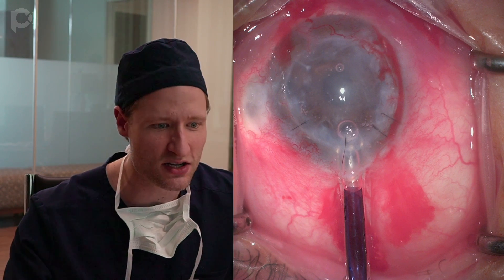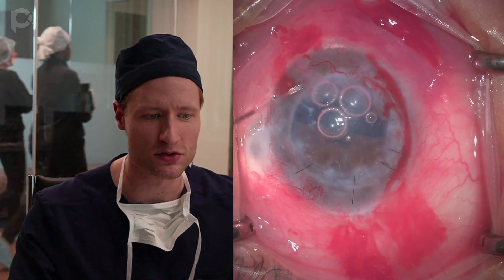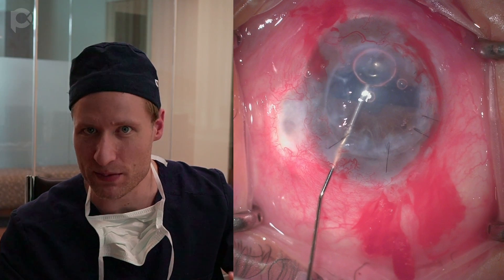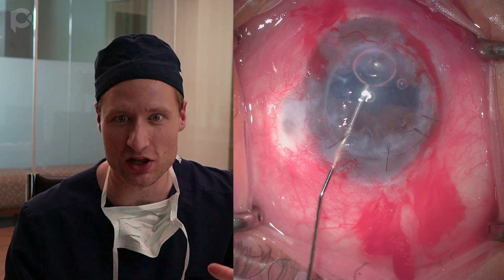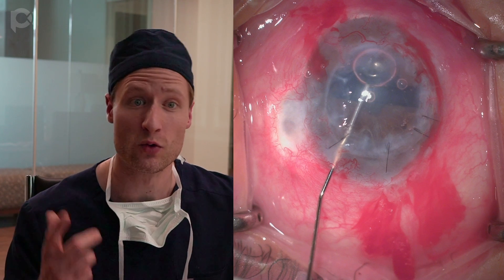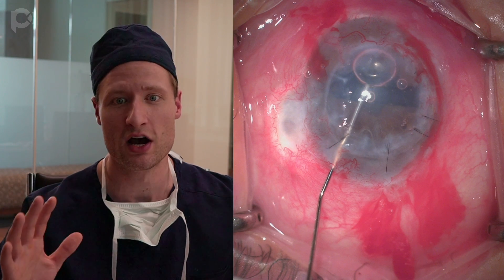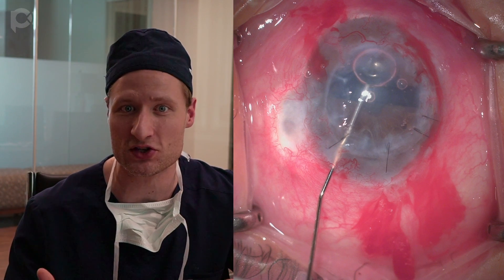Now I'm injecting the graft into the anterior chamber, accompanied by a few little bubbles. The first thing to do is remove these bubbles by aspirating with a BSS-filled cannula. Here's an important tip: never aspirate bubbles with a cannula connected to a syringe filled with air. If you aspirate air with an air-filled syringe, the next time you inject air with that syringe you'll get foam — that explosion of air bubbles into the anterior chamber. If you don't aspirate air with the air syringe, it won't happen.